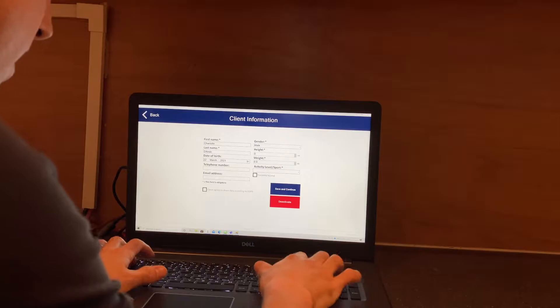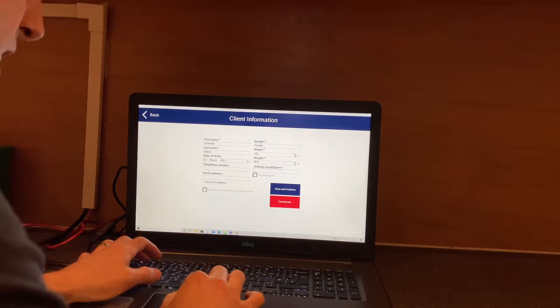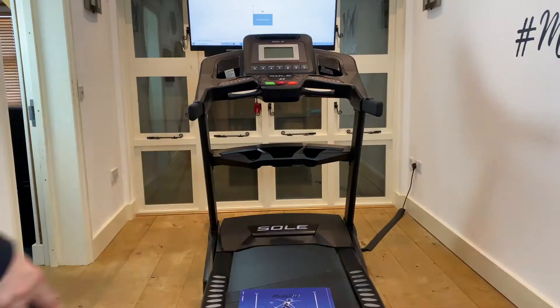Welcome to using Run3D within NK-Active. This is our 3D gait analysis system.